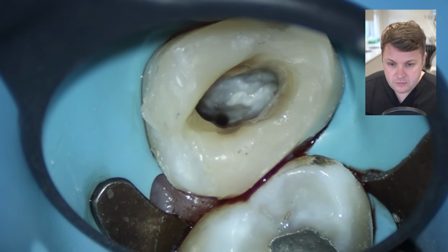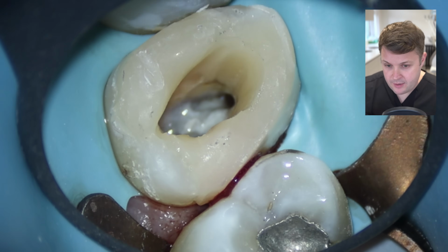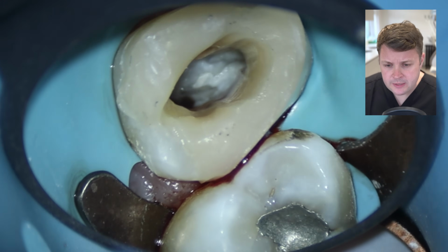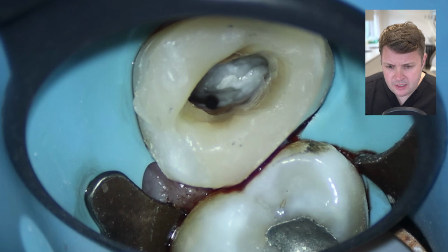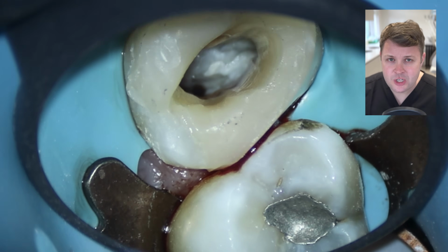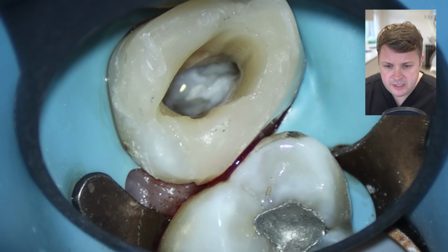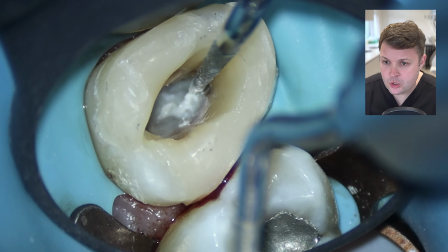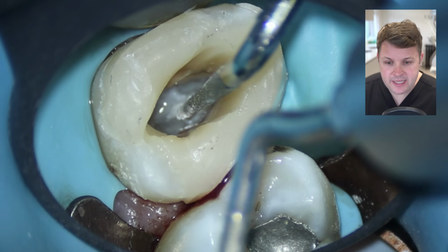So we found the palatal, we found the DB. You can see it's in an unusual position. Now I'll be looking for the MB2. And when we look here, we can see there's a suggestion of an MB2 orifice. And straight away, what I'm thinking to myself is, does this MB2 join with the MB1?